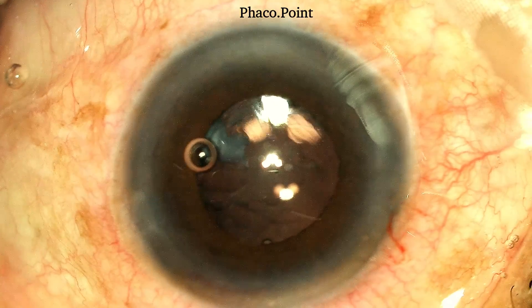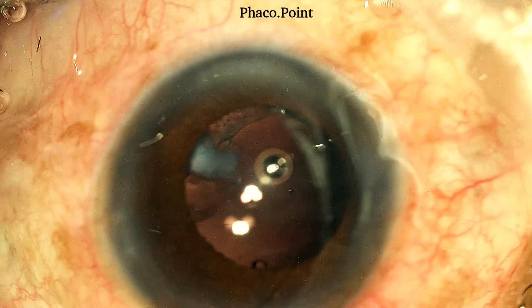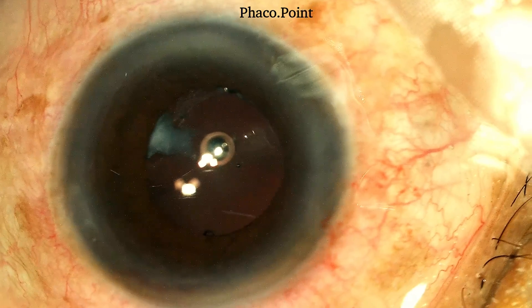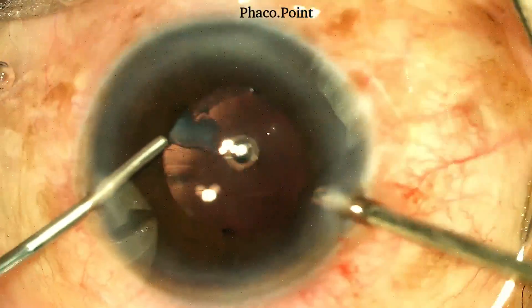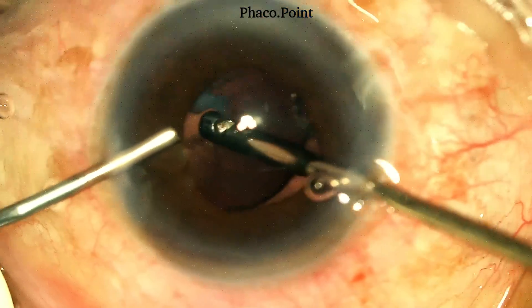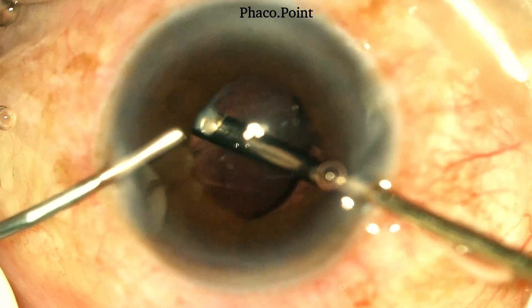The plan is to remove the cortex with the vitrector, which we introduce from the opposite side. In order to enable smooth entry of the 20-gauge cutter, the incision is now enlarged. The irrigation is introduced from the left side and watch how the 20-gauge cutter is introduced into the anterior chamber behind the IOL, goes into the area of the residual cortex overlying the rent, and cuts and removes the residual cortex.